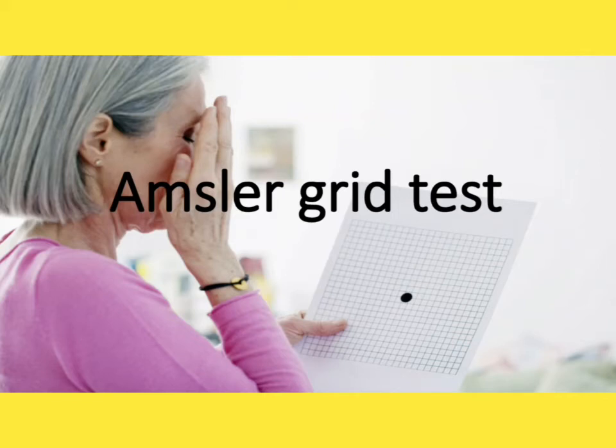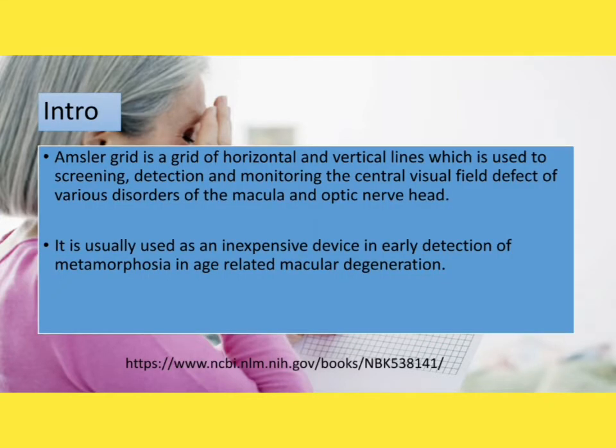So today in this video, I'm going to discuss with you all about the Amsler grid test. Okay, so let's start. Before going to the discussion on the Amsler grid test, first of all, let me give a brief idea about the tool that is used to perform this test, that is the Amsler grid card.